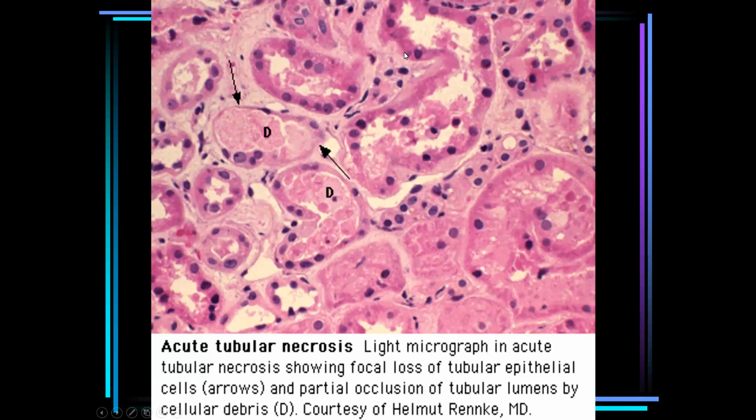Similar in this situation, this is a proximal convoluted tubule. You see the brush border here, it is partly detached. And the type of cells present and the wider lumen, this is typical. This is also of the proximal tubular cells. So these are the findings of acute tubular injury. This is the preferred term now.